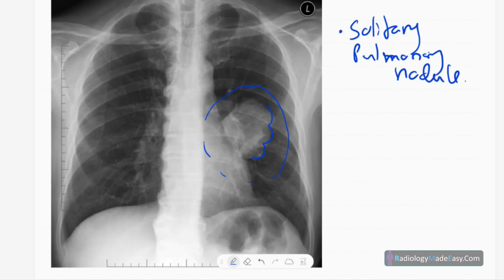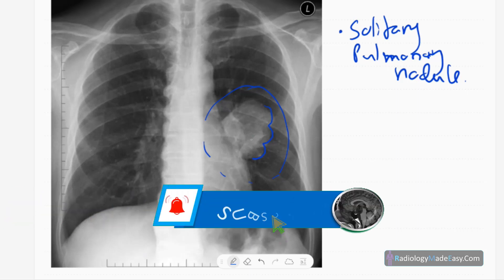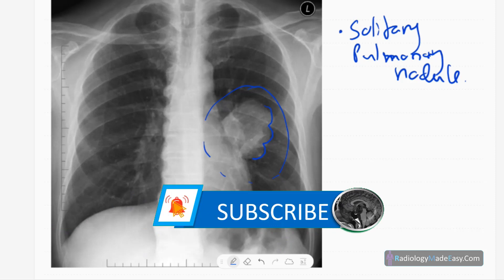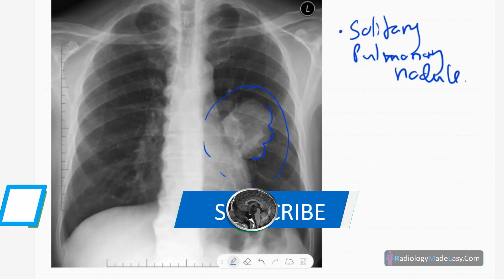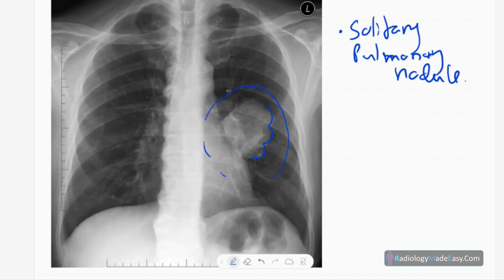There is no air-bronchogram formation — it is a more homogeneous mass. No air-fluid level, no calcification, and no cavity formation. The underlying bones appear normal with no lytic or sclerotic lesions, and no synchronous lesions seen in the lungs.